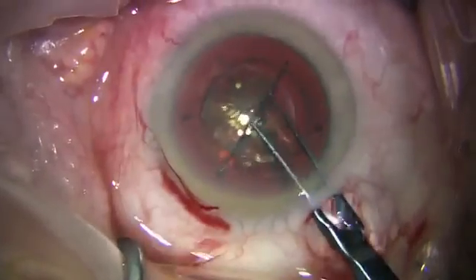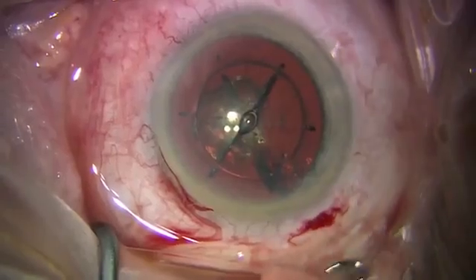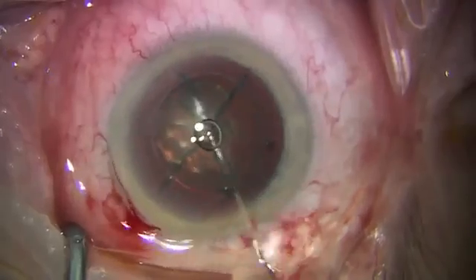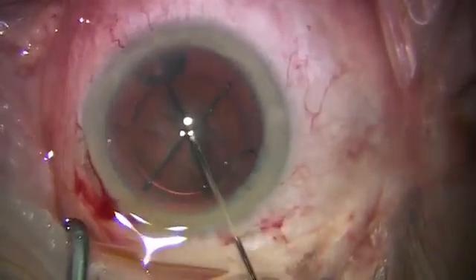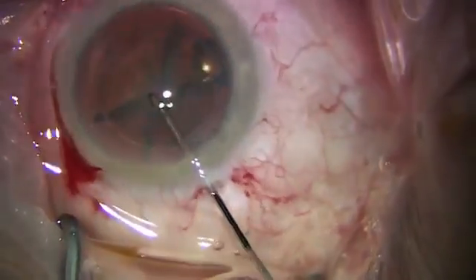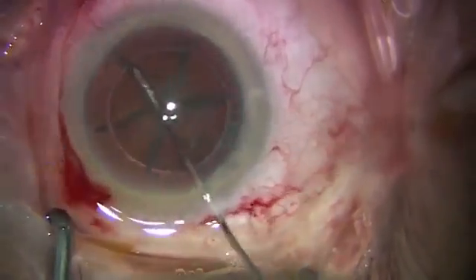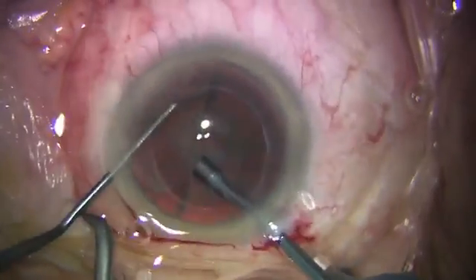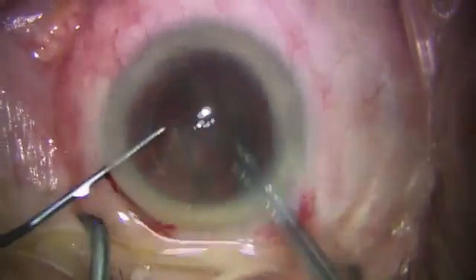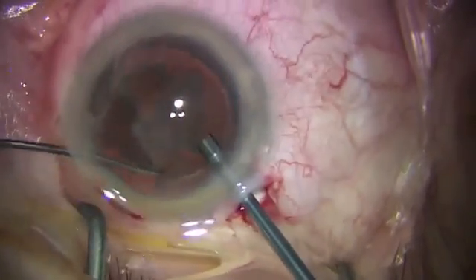To demonstrate the process of translenticular hydrodissection again, the anterior capsule is removed using forceps. The cannula on balanced salt solution is introduced into the eye and inserted into the lens through one of the lens fragmentation incisions. Fluid is injected, resulting in a fluid wave and displacement of the posterior gas bubble. The lens is easily rotated and the cannula is used to chop the lens further. This prior hydrodissection and lens fragmentation allows rapid segment by segment removal of the lens nucleus. Effective phaco time in this case of a fairly soft grade 2 lens was less than 0.1 seconds.